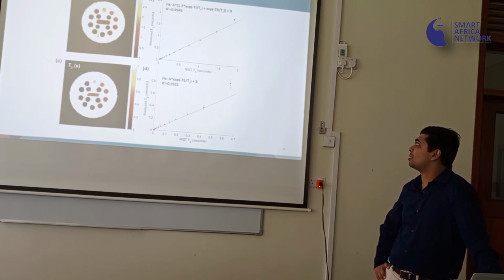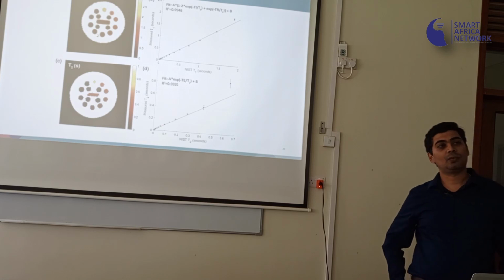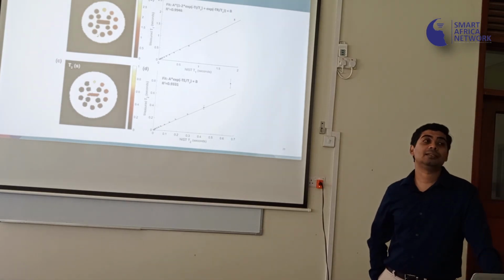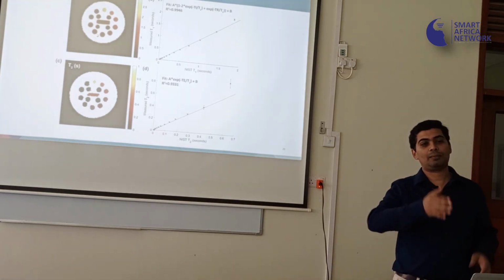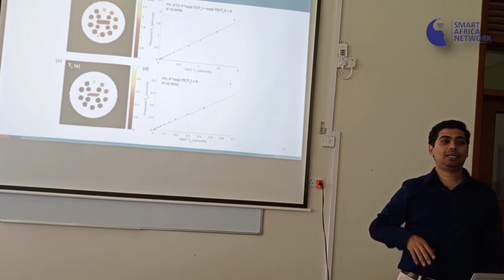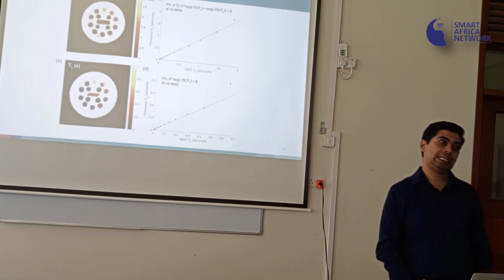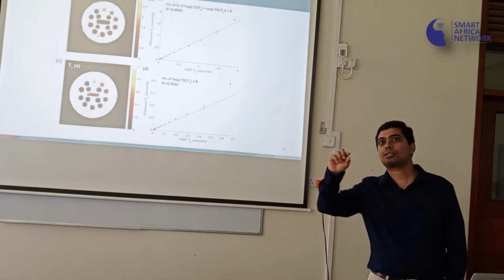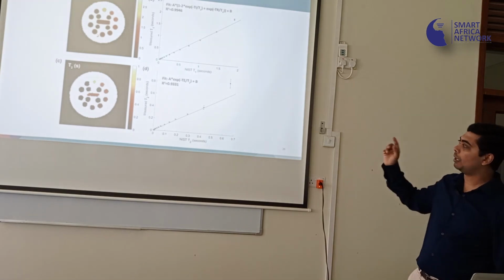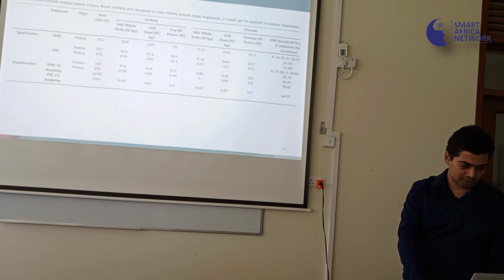And you can see that the sequences do pretty well with what is known as the R-squared fit to show that you can rely on these sequences even if you were to do quantitative imaging. At low field, this is very relevant because of the following. Because it's low field, you probably can image multiple times, but you probably won't get the signal to noise ratio of a 1.5T or a 3T. So if you have quantitative imaging, then you can actually pick out small changes over time, which is super meaningful. For that, you need tools like this that can work on quantitative imaging.